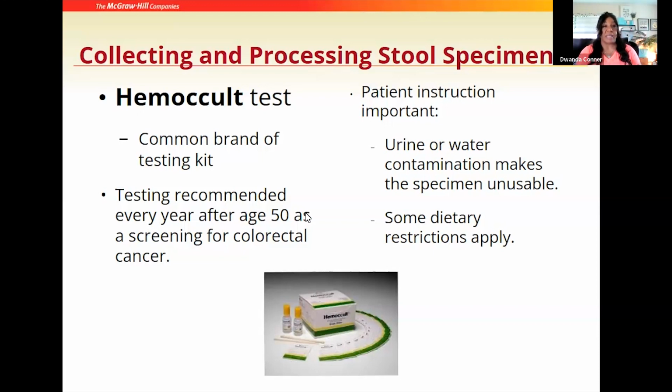Now, with this test, testing is recommended every year for individuals over the age of 50 as a screening for colorectal cancer. Those patient instructions, again, making sure that the stool specimen is not contaminated by water from the toilet or also contaminated by urine. And there may be some dietary restrictions that would apply, and that would be given to the patient by the provider.